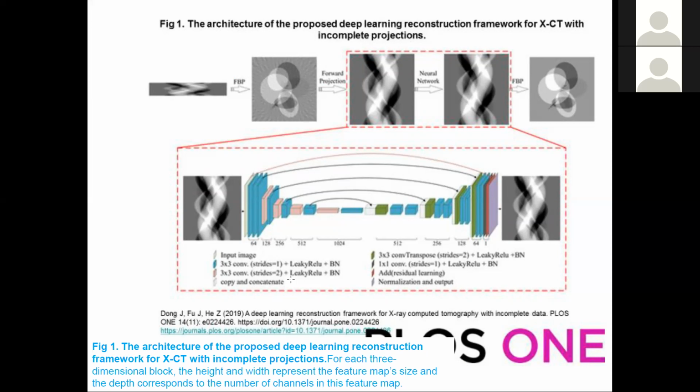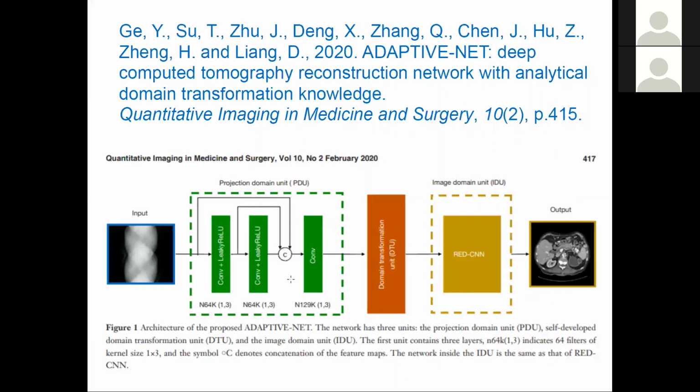And the neural nets, the ones people like, I like this particular image because of its dimensionality, all that stuff's on the inside. But you can read all about them, I'm sure you all have. This is another instance of that, from a group just this year doing CT, where, in order to do the forward projection, they still did it using nets, but not normal nets. It's not supported by TensorFlow. They had to make their own device in the software, but they could do it. So it then becomes a question of computational efficiency.